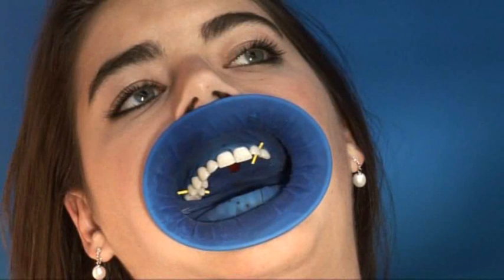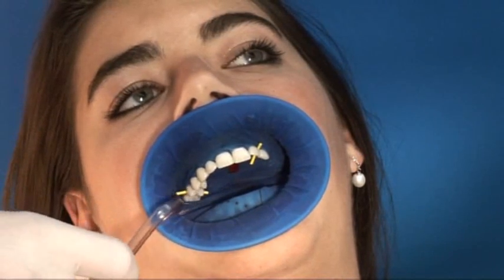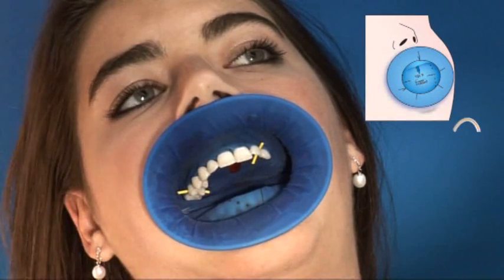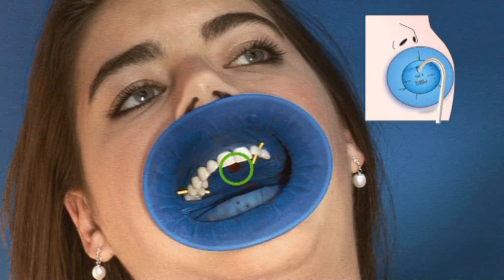To suck up processing material and spray water, place the small aspirator behind the left or right cheek into the deepest point of the bag, where it is automatically removed. To suck up the saliva behind the Optredam, introduce the small aspirator through the slit and apply brief suction intermittently on the left and right side.